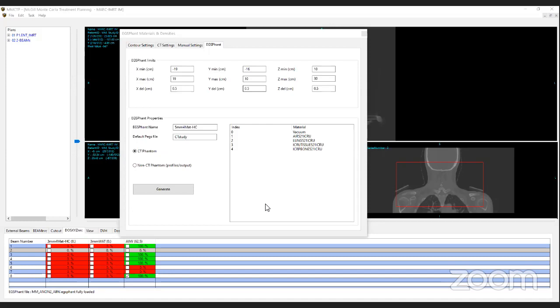Yes, I'm already working on that. I already have the geometry. I'm building the beam already. Okay. Yeah. Thank you. Okay, I'm going to continue.